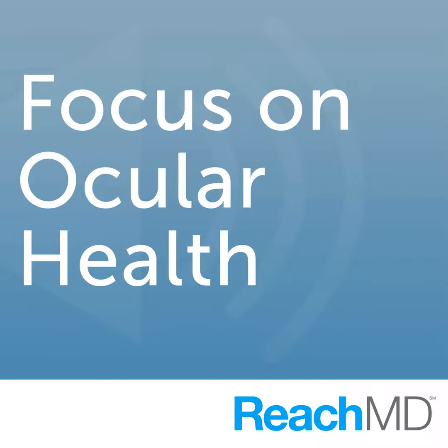Correct. What you need is not all of the optic nerve. We found about 30% of the optic nerve you need some connection from the eye to the brain, and what the chip does is jumpstart the nerve cells in the eye, and these remaining fibers then connect that information and pass it along to the brain.